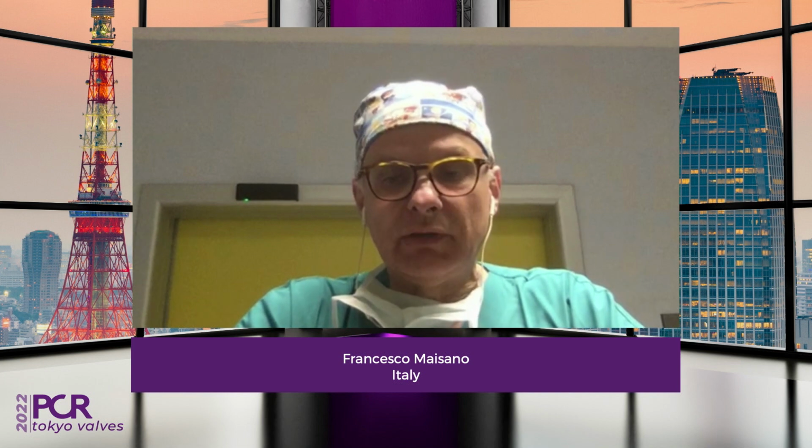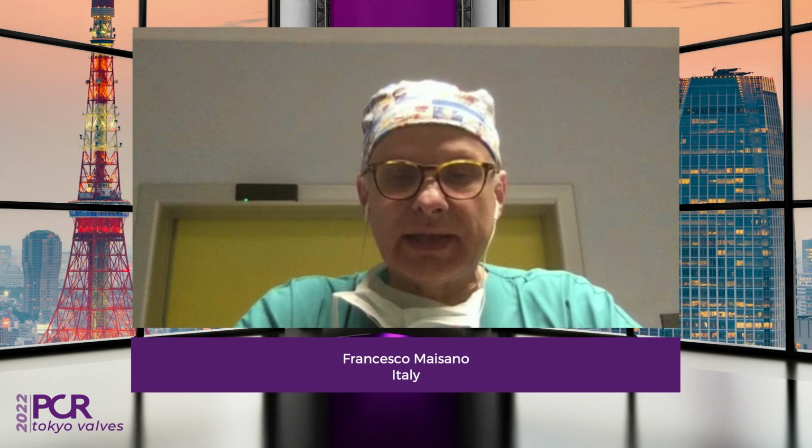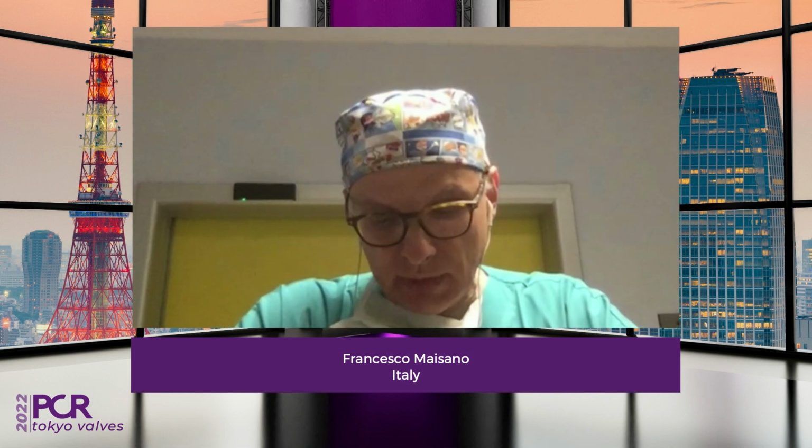Yeah, so first of all, these patients should be treated very carefully because you may have suboptimal outcomes even if you achieve coaptation, if you achieve a good grasping. Unfortunately, if you have a large coaptation gap, even after the procedure, in the next days, you may have some leaflet detachment. So don't forget that there are still some limitations for edge-to-edge repair in tricuspid. Anyhow, in many patients, we push the limits.